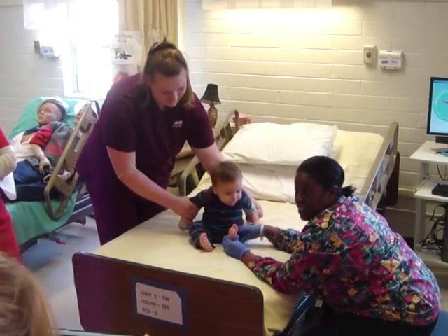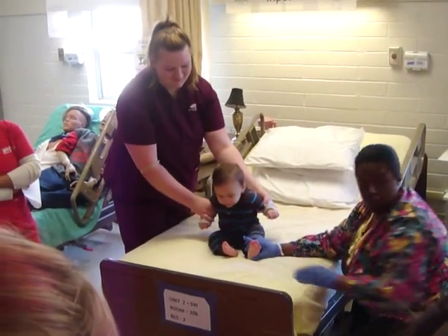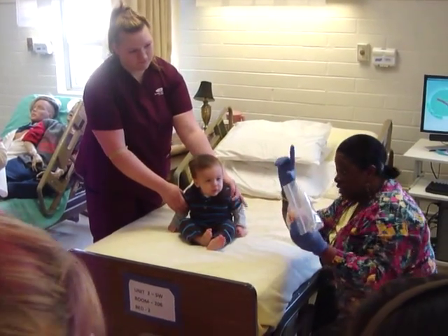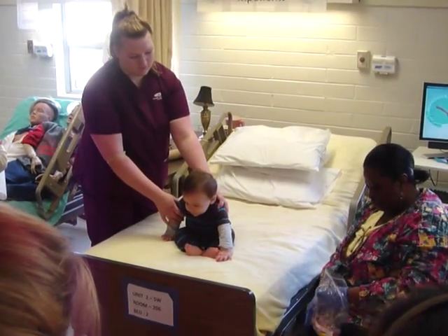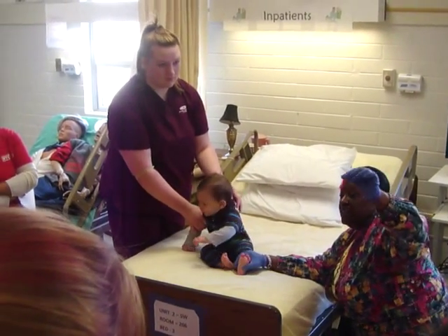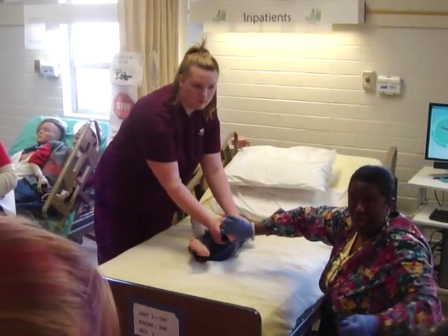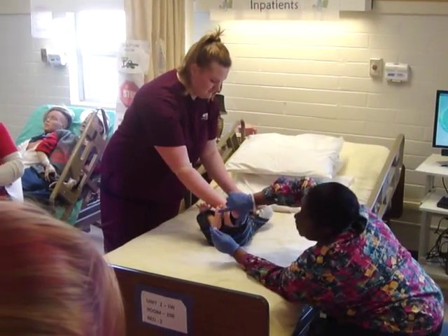I take my cotton and cover the site. So that was just if I had the PKU. But if I still had other tubes to draw or other tests, these are the microtainers we use for infant draws because it's less volume. Another test at this age could be the bilirubin — you see how this tube is an amber color? Bilirubin, we have to protect from light, so it's an amber color. If I needed more blood, I wouldn't have stopped — I would have just kept getting that blood droplet. It's not easy, but it's possible. Babies move a lot.